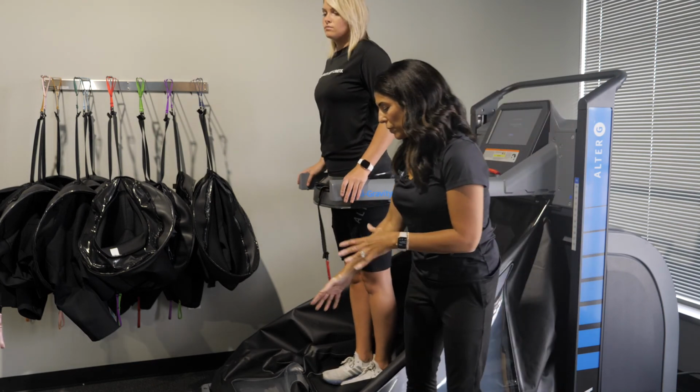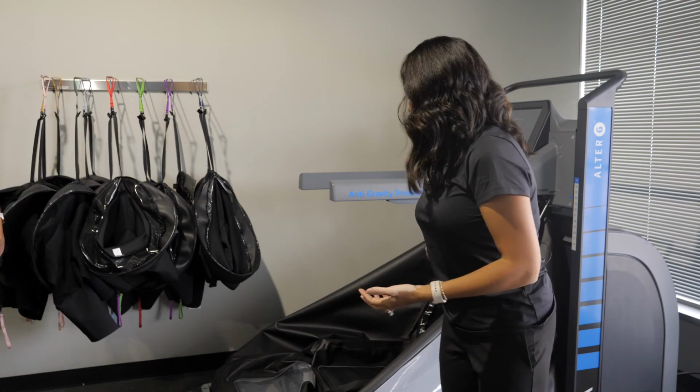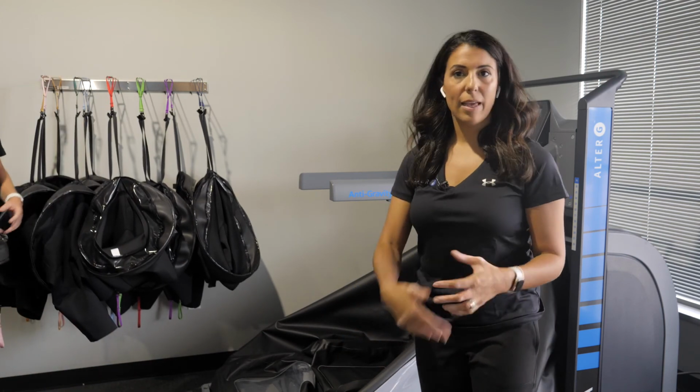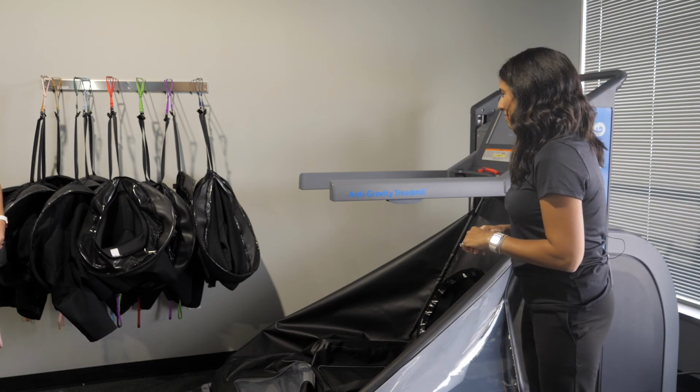There is no area of the treadmill bag that can't be stepped on, so they can step directly onto the hard part of the bag as they come off of the treadmill. So really easy to get on and off.